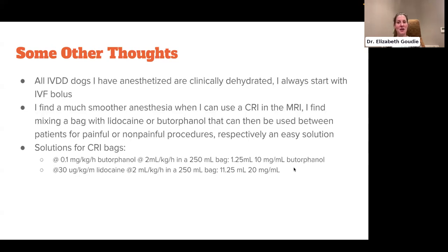If they're coming in in respiratory distress and going to critical care or ER first, yes, they may need a trach put in already. If they're already on the vent and getting an MRI to see what's in their brains because they came in from a trauma like a TBI, I could understand those animals maybe having a trach, but I don't rush to it.